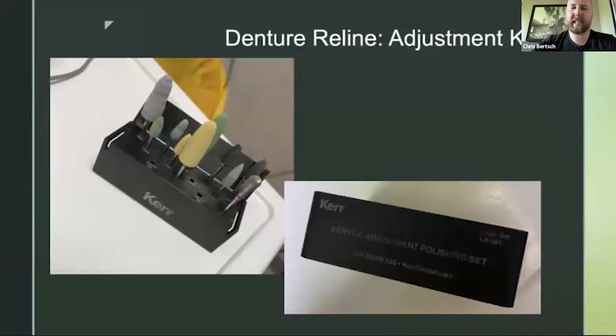This is my denture adjustment kit. Again, I had a question on this. This is awesome because then I can bulk up the presentation. So this is my favorite. I've been using this one since graduating. I really like the pear-shaped one because it so beautifully trims the acrylic. And then you have 3 different polishers there, which is really nice to just chair side polish and smooth out the denture before giving it back to the patient. And I just polish it under the sink with running water, just so we keep it nice and clean and don't get a lot of buildup of the debris.